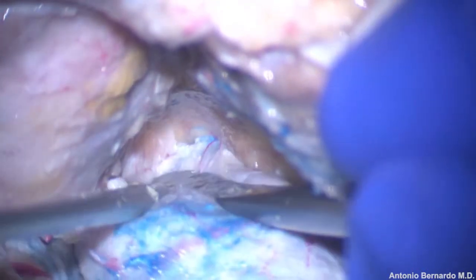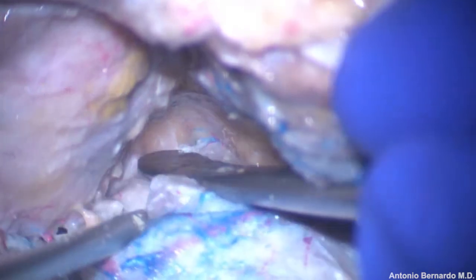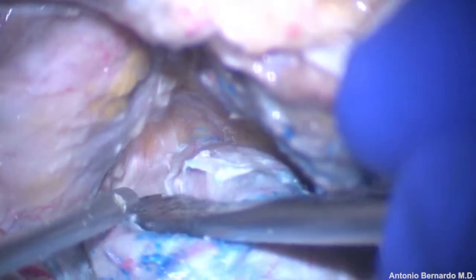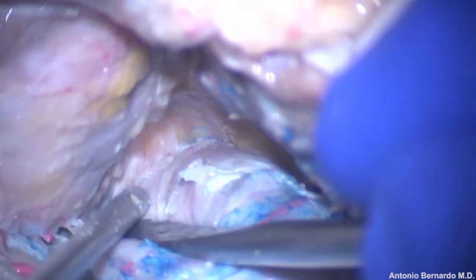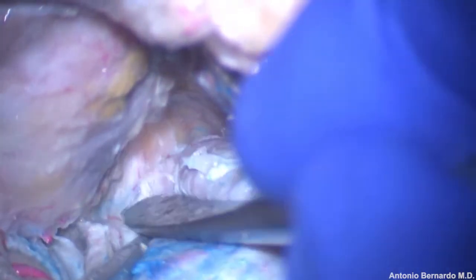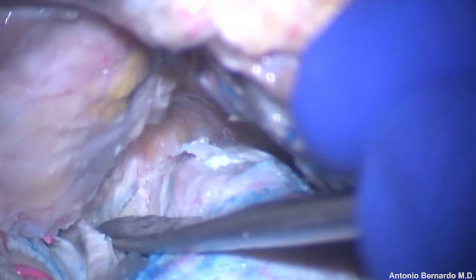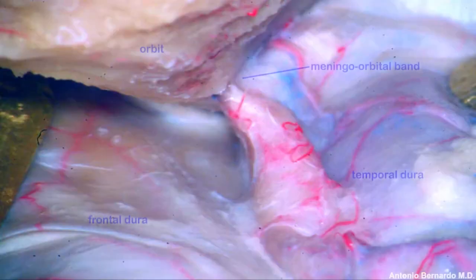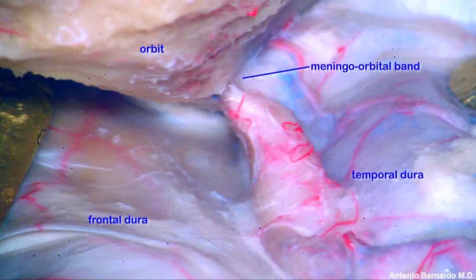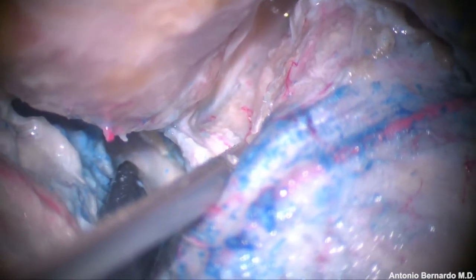The dura is detached from the base of the skull anteriorly. The foramen rotundum is exposed as well as the superior orbital fissure. On the lateral side of the superior orbital fissure, between the greater and the lesser wings of the sphenoid bone, the periosteum of the orbit is continuous with the periosteodura of the middle fossa, forming the dural bridge. The dural bridge is usually very short, only 3-4 mm.